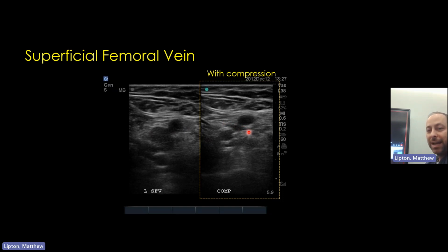If you scan with the radiologist when they do this, it's crazy how much the sonographer makes or breaks this scan. The radiologists freely admit, the sonographer kind of does everything here, and they just scan through the images and they're like, yeah, no DVT, or whatever the sonographer says, because it's so hard to override the interpretation of the sonographer when they're doing DVT scans, that I feel like the sonographer should make the radiology money in this scan, but they don't. So sonographer makes or breaks it.